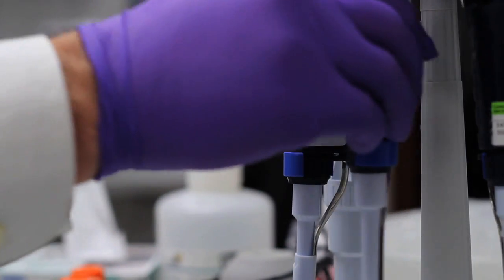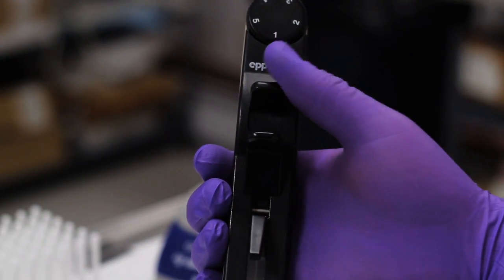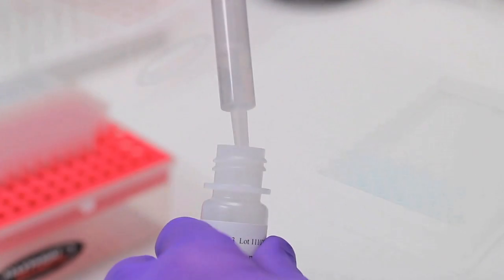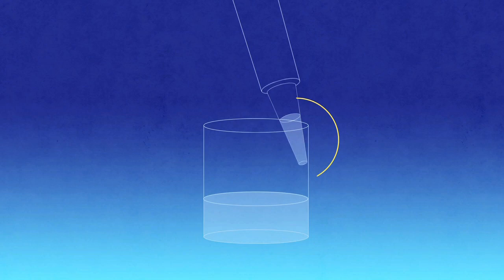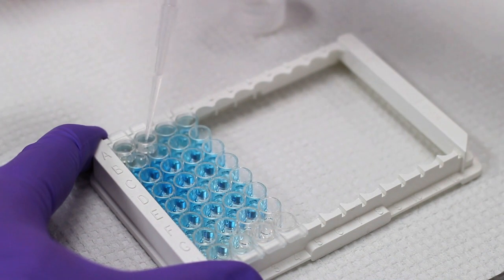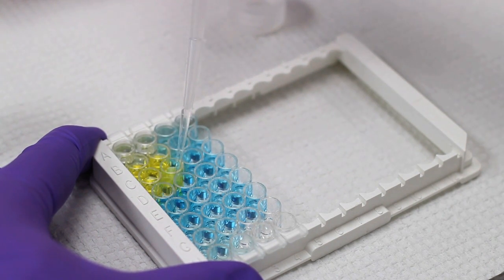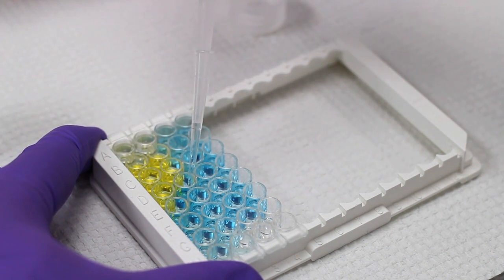Following the incubation period, use a calibrated single channel repeating pipette and add 100 microliters of HRP stop reagent to each well, once again placing the tip at the top of each well. Once the reagent is added to the well, the color will turn from blue to yellow. The intensity of the yellow should be directly proportional to that of the blue.